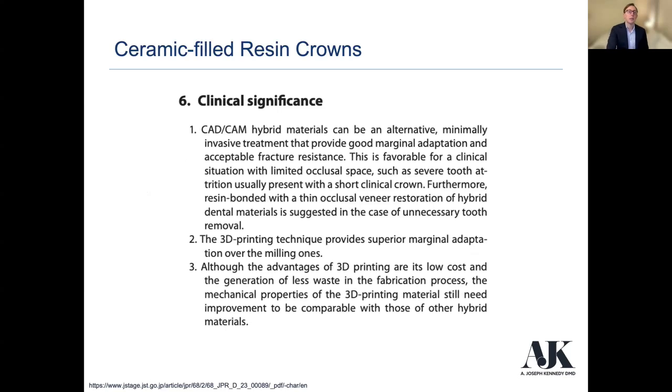study in particular. Clinical significance here is these CAD/CAM hybrids can be an alternative, minimally invasive treatment that can provide good marginal adaptation and acceptable fracture resistance. They've been shown to be favorable for clinical situations with limited occlusal space. We might have severe tooth attrition, short clinical crown. These resin bonded thin occlusal veneer restorations of hybrid dental materials are suggested in the case of unnecessary tooth removal. These 3D printing techniques provide superior marginal adaptation over the milling ones.